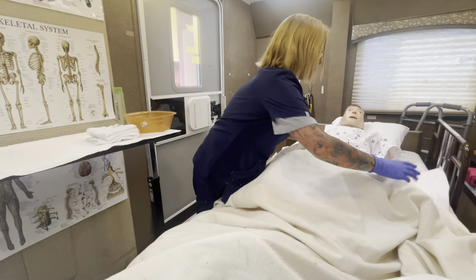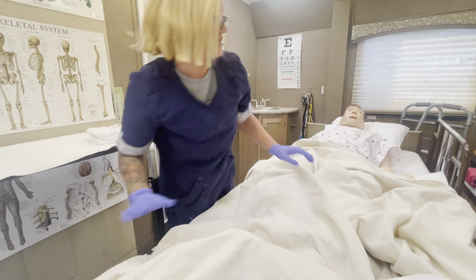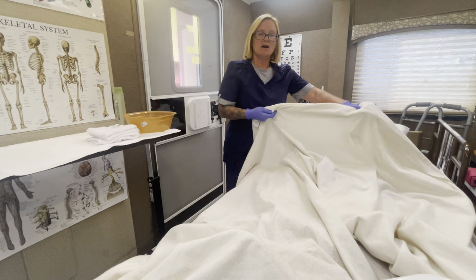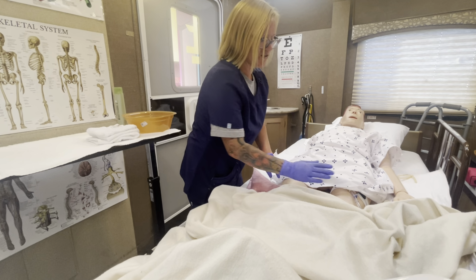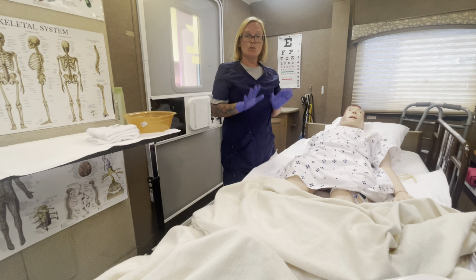So now I'm going to cover the patient back up because the patient should be covered during the procedure, but I just wanted to show you how I would roll the patient. Next thing you're going to do is go ahead and bring your blanket down. You do not want to go past the knees. I always go a little bit above the knees. I don't need to go that far for this procedure. So we're only exposing the area that we're working on.